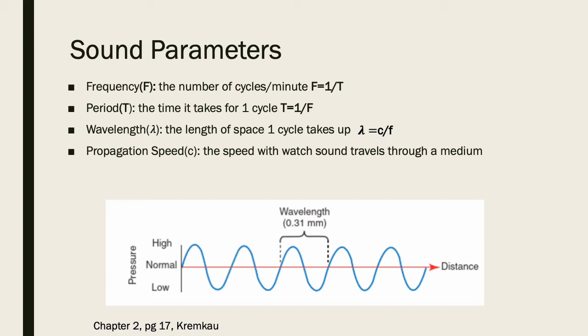So just for right now, I want you to take note of the fact that if I was to increase my frequency right here, and if my C value remained constant, my wavelength is going to get smaller. Or if I increase my wavelength and my C value stays constant, my frequency is going to decrease.